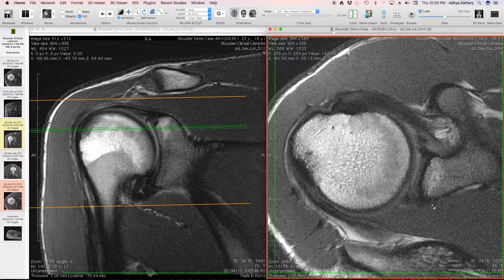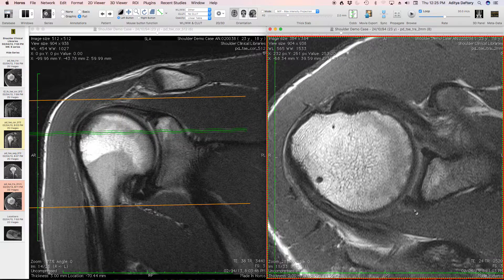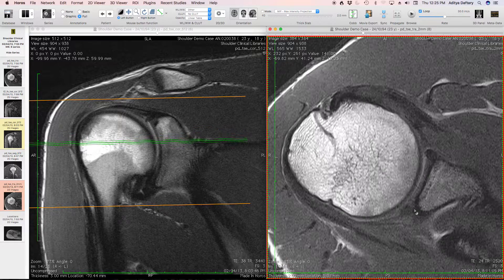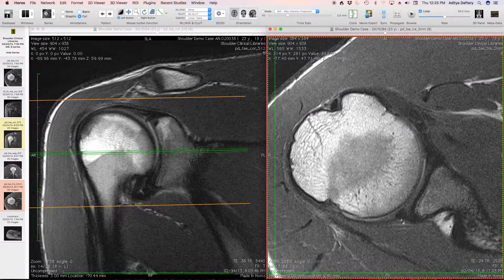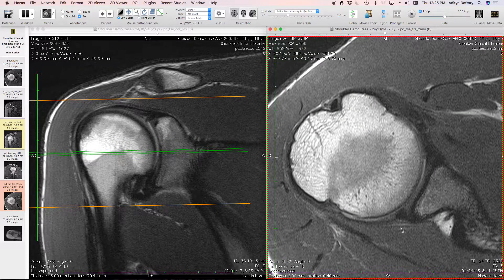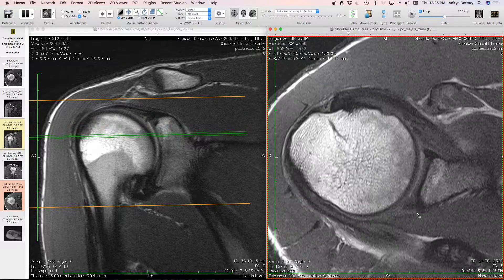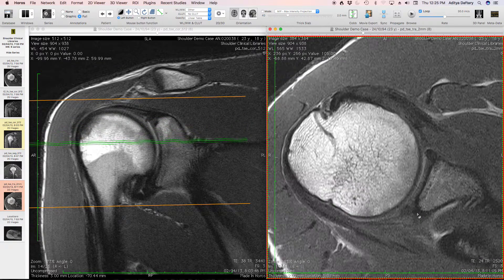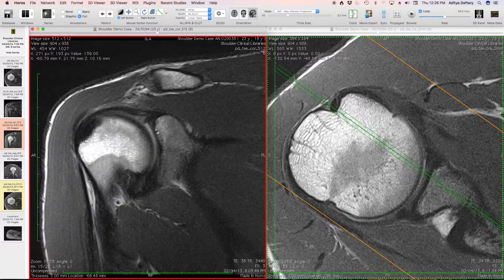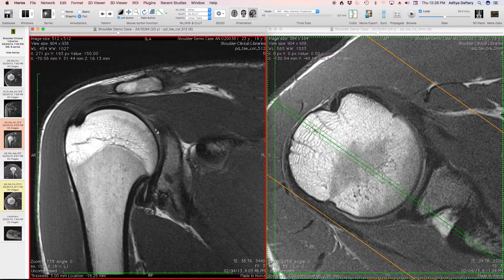Looking at the posterior labrum toward the top, there is a discrete split in the posterior superior labrum. Coming a little lower there is attenuation and fraying — it doesn't look as dark as more superior levels. More inferiorly, once we hit the level of the equator, the labrum appears more discreetly and distinctly. The posterior superior quadrant of the labrum in this case is considerably frayed and likely has a tear within it.